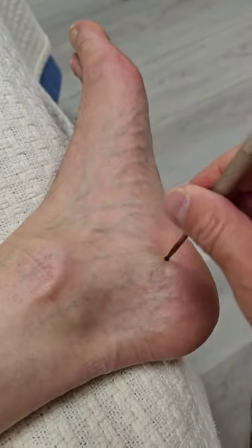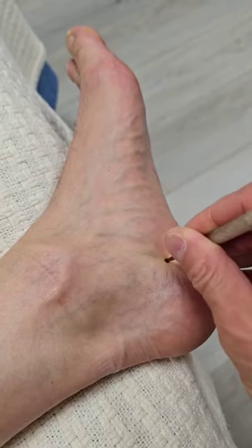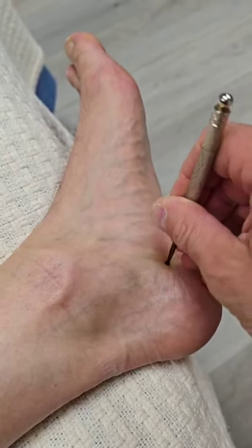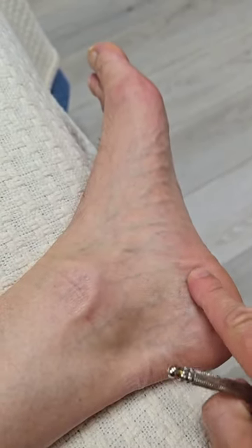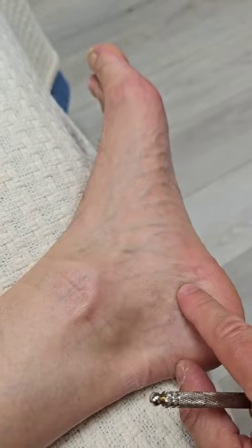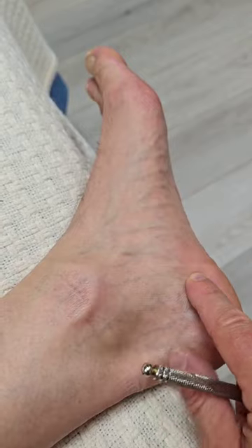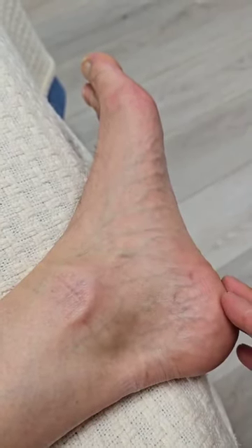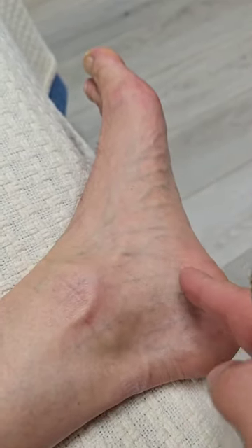And what I would do is I would put that needle just perpendicular into that position there, and then I will fan that forward through the soft tissue, and you can fan it back until you hit the bone as well. So your target through there is going to be abductor hallucis, which can refer pain in, but you can also go down through the plantar fascia. So you've got the plantar fascia as the most superficial structure, and then sandwiched in there you've got flexor digitorum brevis, and then just deep to that you've got quadratus plantae.